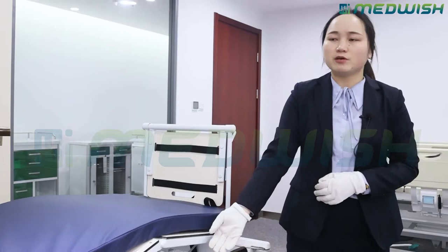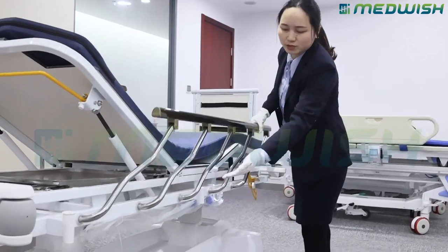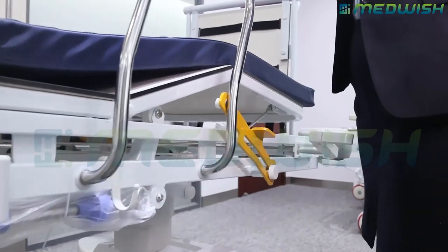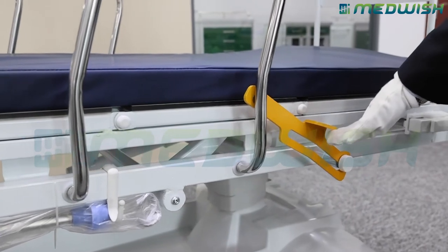As for the guard rail part, this guard rail has a pattern design, especially an implanted design. It is very strong even after many times of use. If you need to lower it down, just operate like this.